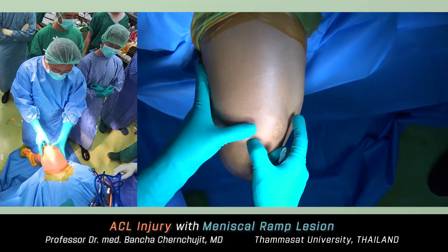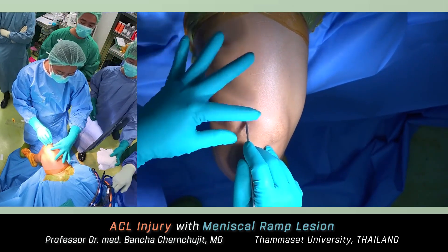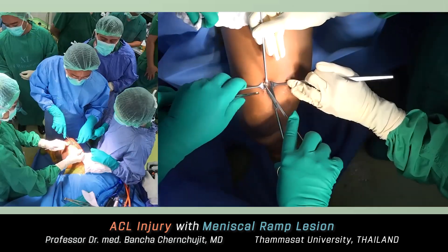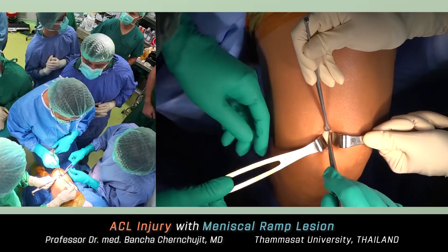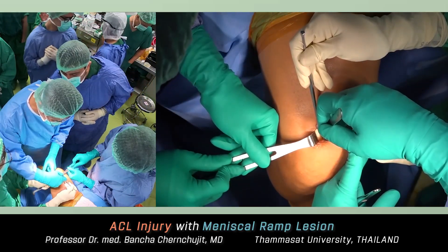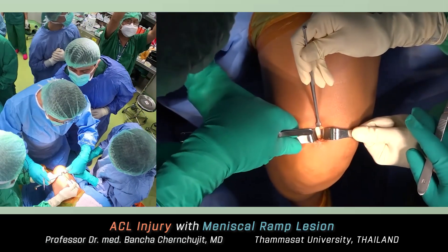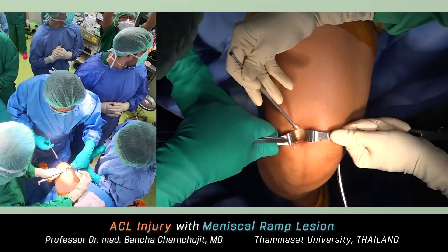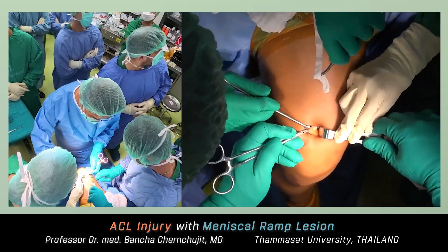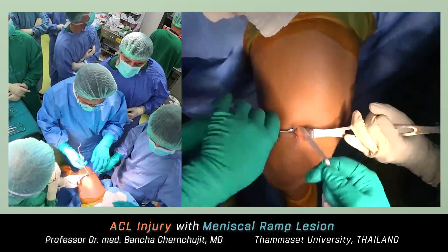I started by harvesting the rectus femoris autograft, making a vertical skin incision at one finger breadth from the upper pole of the patella. After entering, remove the fat tissue. You'll see the white tendon — the red fiber on the lateral side is the vastus lateralis. Incise the tendon tissue just next to the vastus lateralis and move slowly to the medial side. Use right-angle clamps to go underneath the tendon, just the superficial layer, then retrieve the cord tape under the graft.